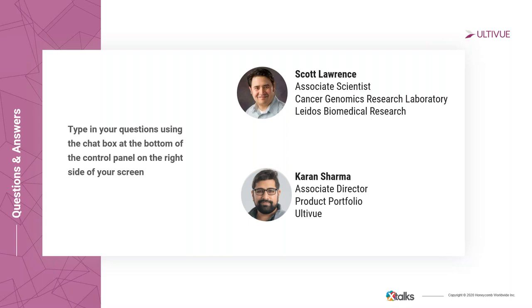Thank you. Our next question is, can this assay be used with RNAscope ISH? Yeah, that's a really good question. So we actually have a couple of researchers that are looking into that right now. I know that the current approach is to do RNAscope and then a TSA-based assay afterwards. What some researchers are looking into now is if we can do InSituPlex first and then after that do RNAscope ISH, because we are only doing one antigen retrieval versus multiple. So we don't have data on that yet technically, but we do have researchers and collaborators that are currently looking into that.